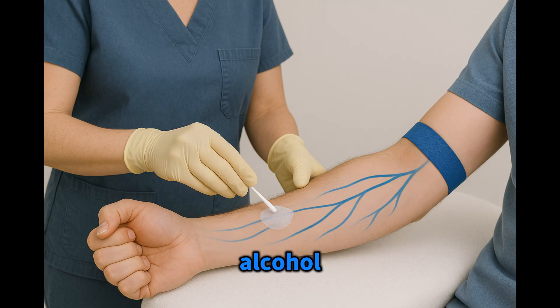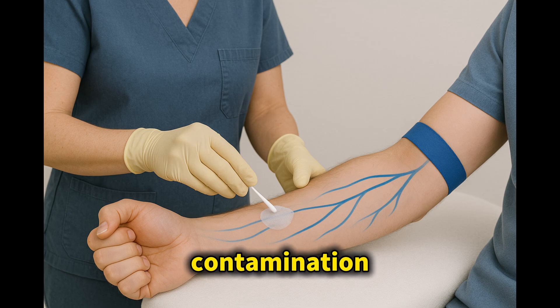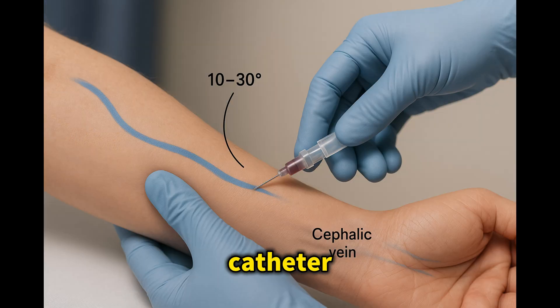Step 3: Cleansing and Catheter Insertion. Using chlorhexidine or an alcohol swab, scrub from the center outward for at least 30 seconds. Let it air dry completely — never blow or wave it dry, as that risks contamination. Now grasp the catheter close to the hub with your dominant hand, bevel up at a 10 to 30 degree angle, anchor the vein with your non-dominant thumb, and insert the needle slowly. Look for a flashback of blood in the chamber. Once you see it, lower the angle and advance the catheter slightly until it sits fully in the vein.